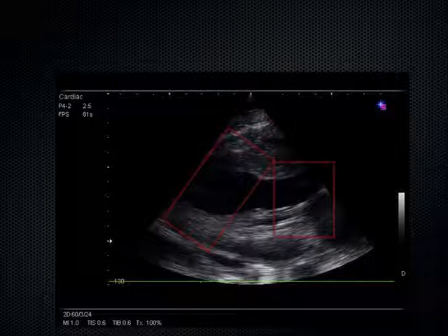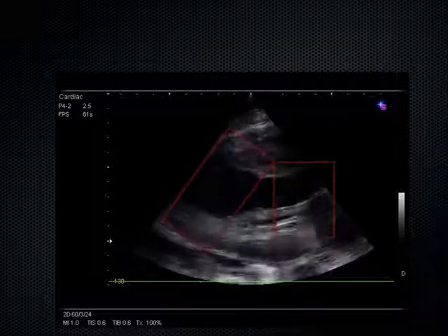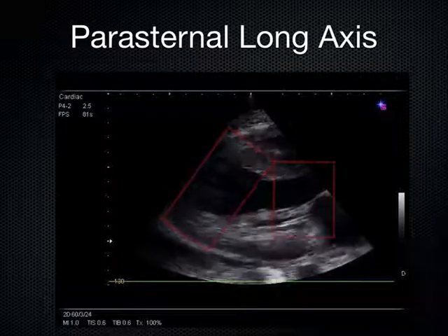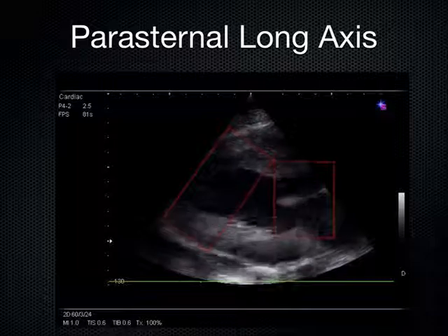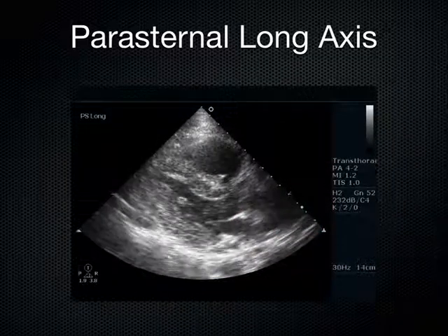Because when the nurse comes to you and says, hey, this patient's hypotensive, we've got to resuscitate this guy, how much fluid should I give him? That's their first question to you. So you just got to be very careful there that you don't just start dumping fluids into a heart that looks like this. That's why, with anybody who's hypotensive, I immediately go to the bedside and take a look at their heart, and then I make a decision about whether or not to give fluids at that point.